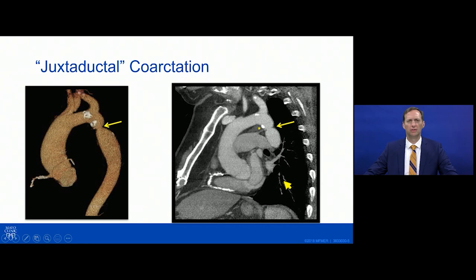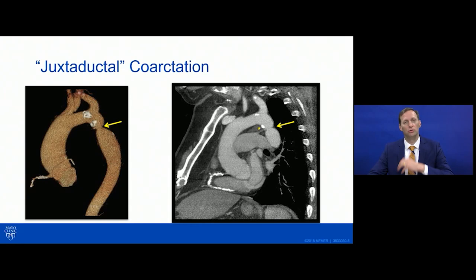This is a 3D reconstruction of that same CT angiogram. You'll notice calcification in the region just proximal and beyond the narrowing, and calcification in the coronary arteries. Early coronary artery disease and stiffening and calcification of the aorta are certainly things we worry about in patients who have had coarctation over their lifetime.